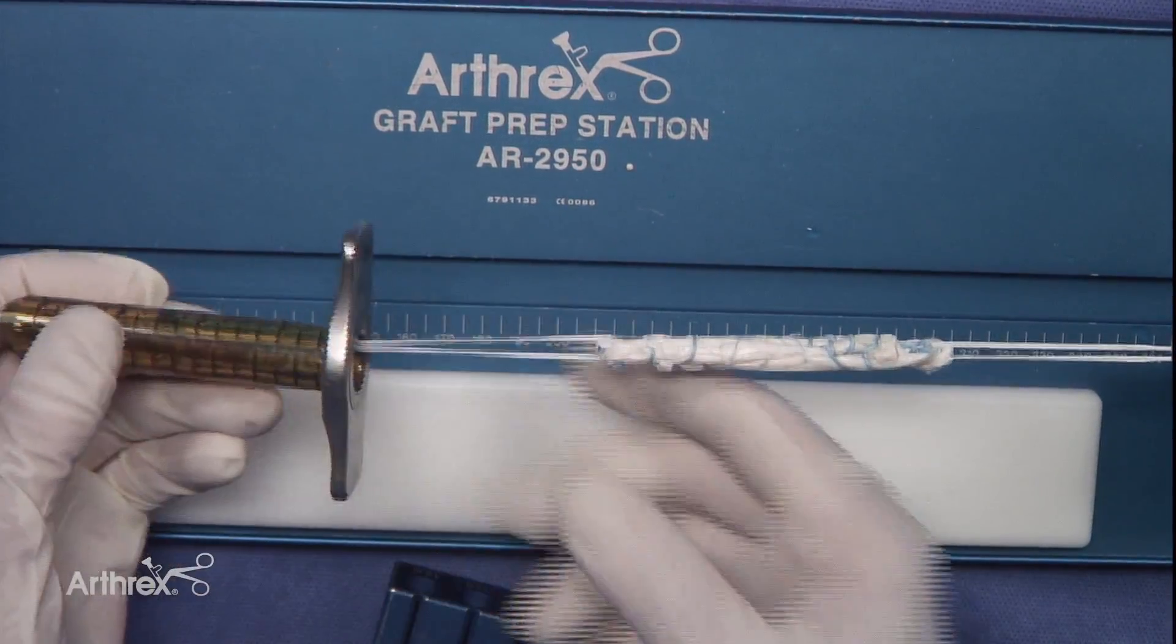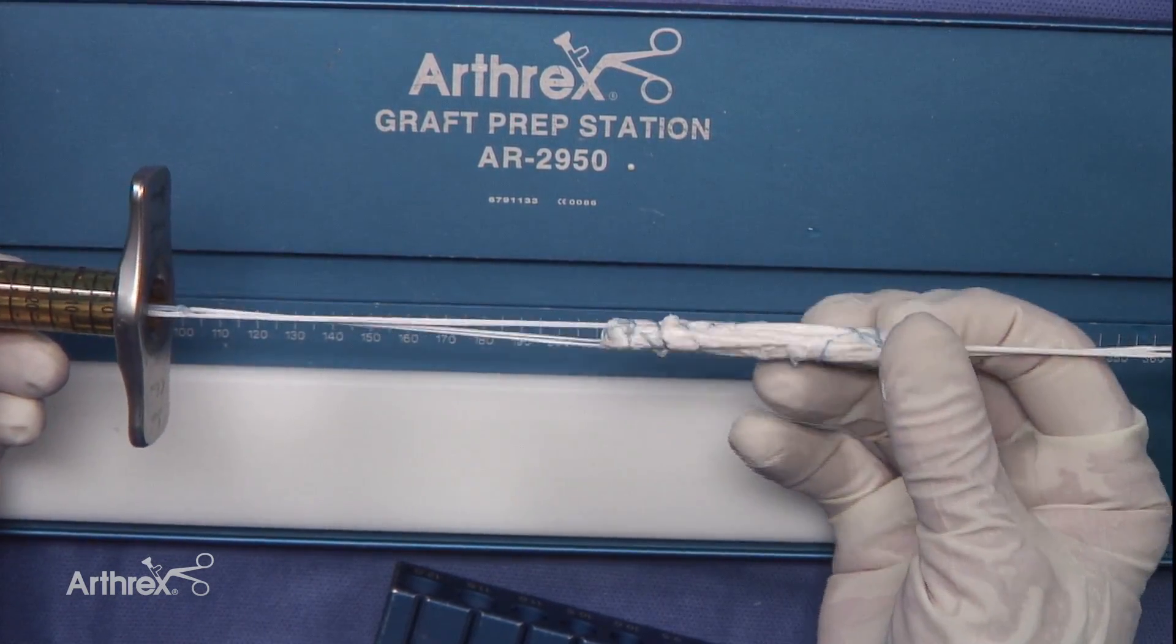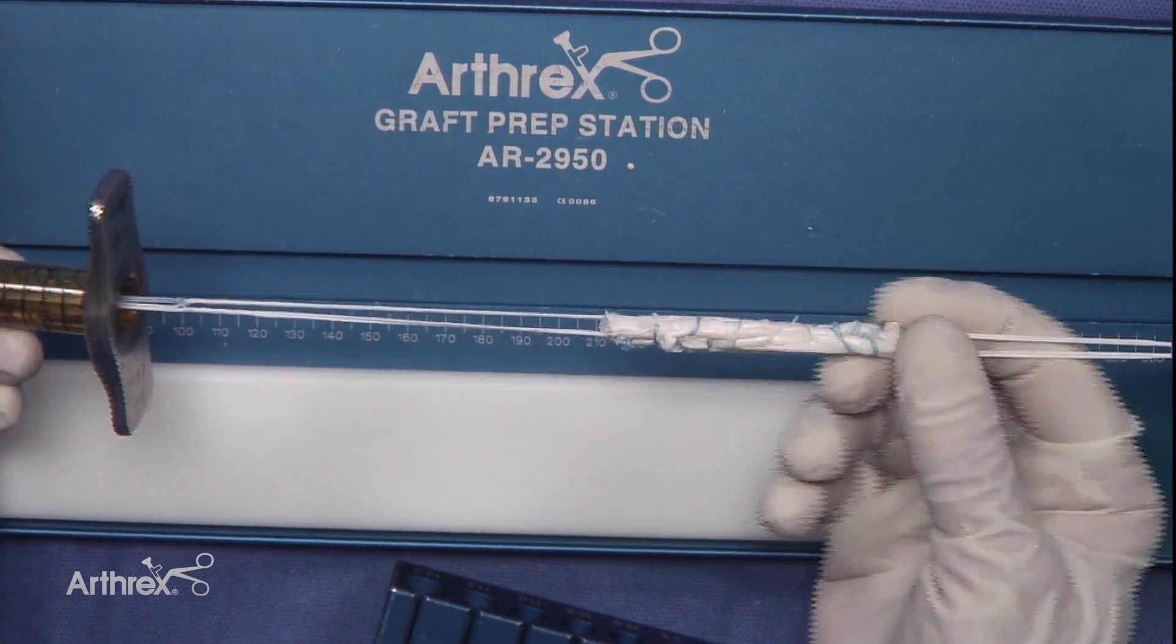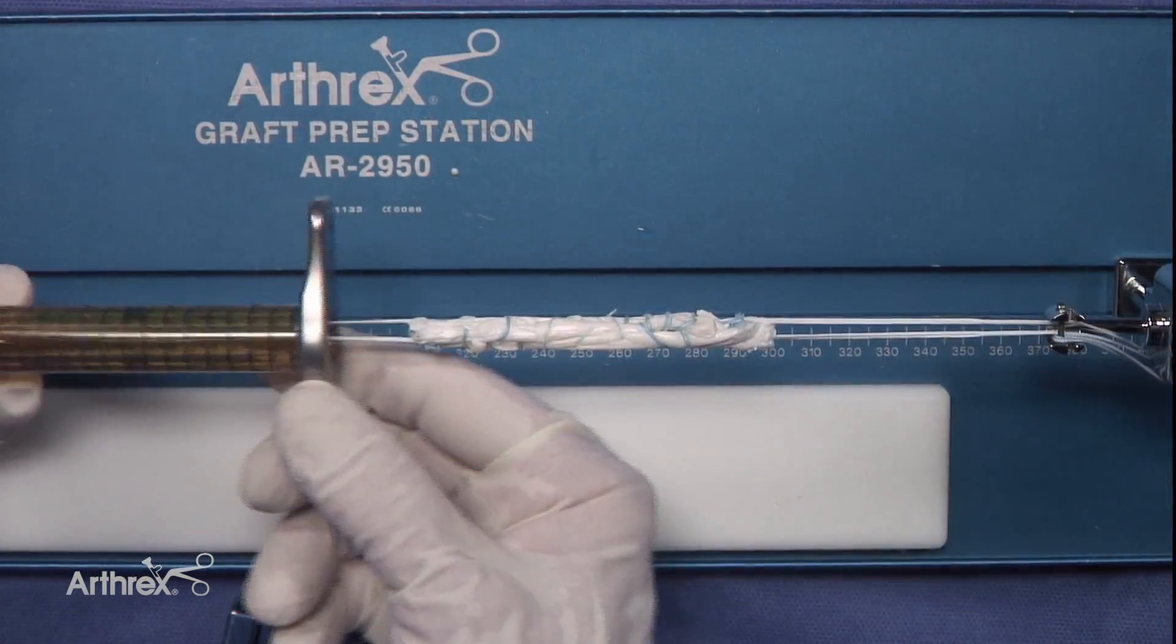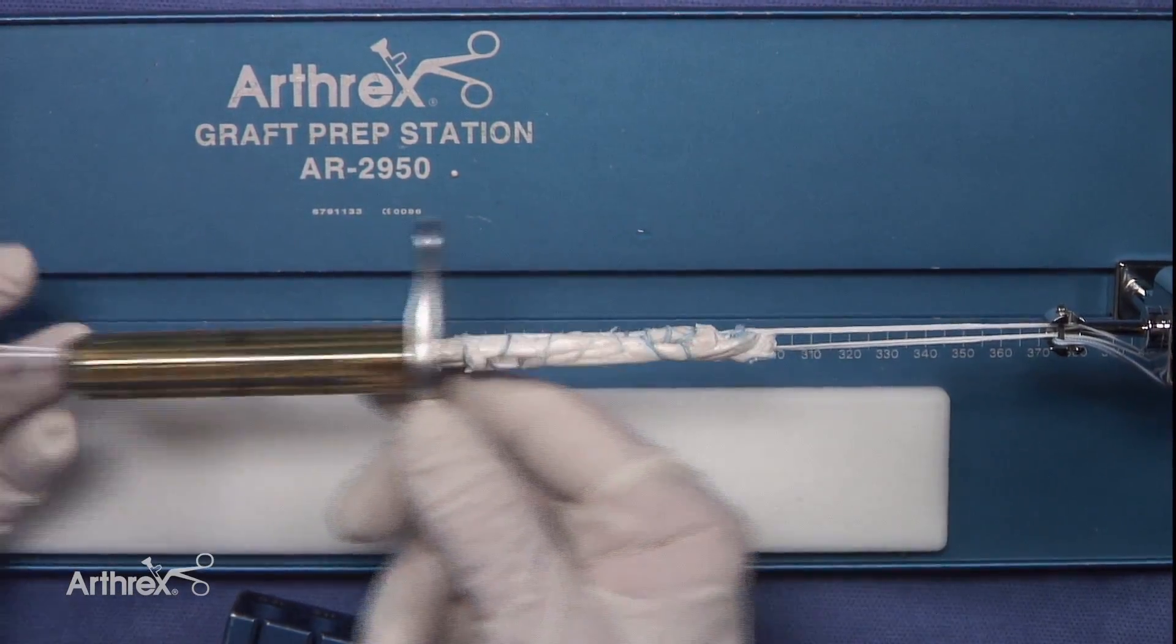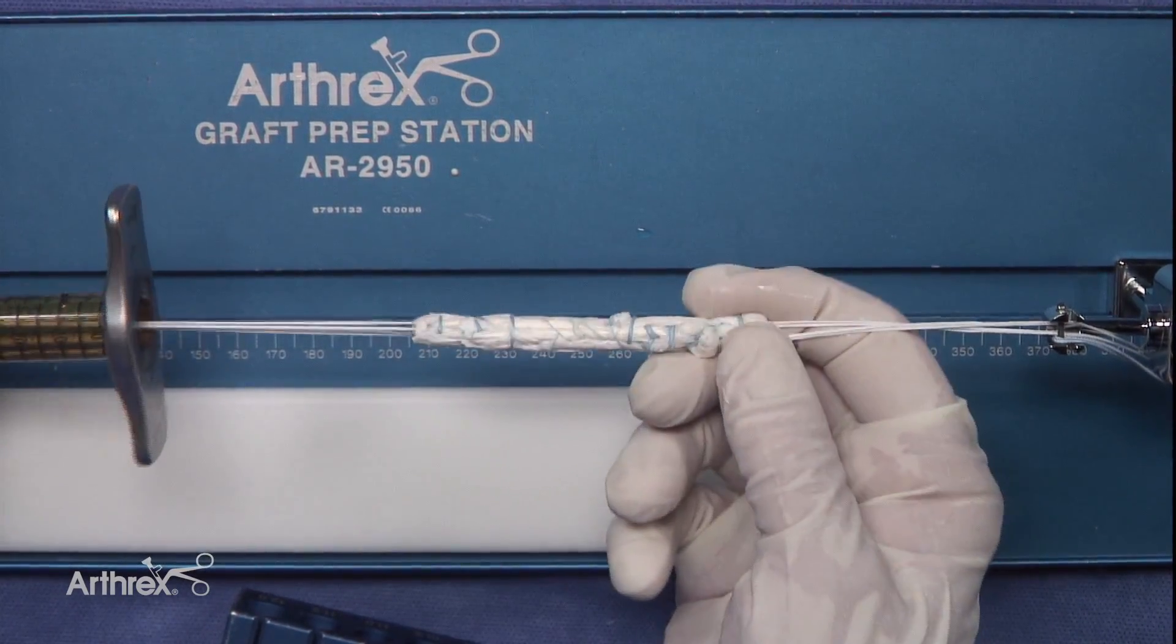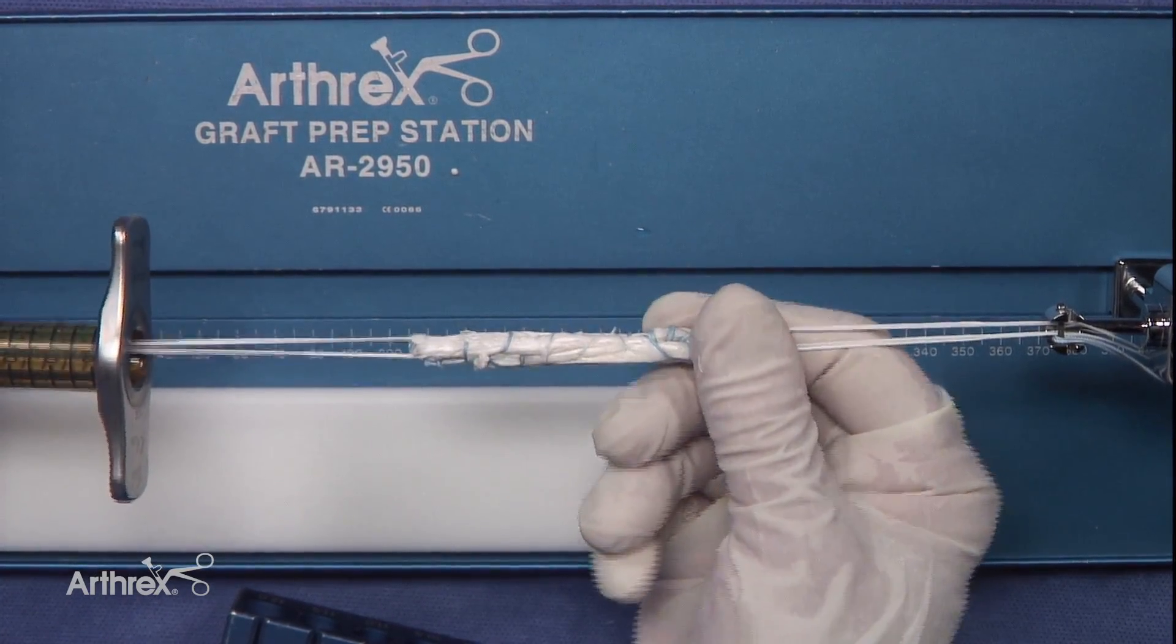What we've gone to now is a nine diameter graft, and we started with approximately 7, 7.5 millimeter graft. This would be a very suitable graft for implantation. If we bring the graft tube up, you can see that it is a 75 millimeter graft. This would be a nine millimeter by 75 millimeter graft, which would be certainly an excellent graft for fixation. We started with a graft that was going to be in the seven millimeters.